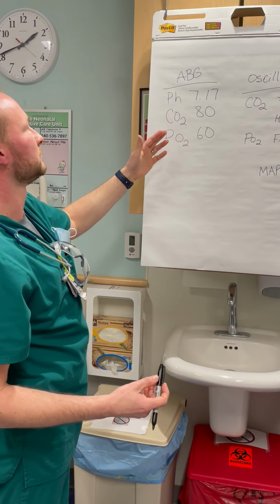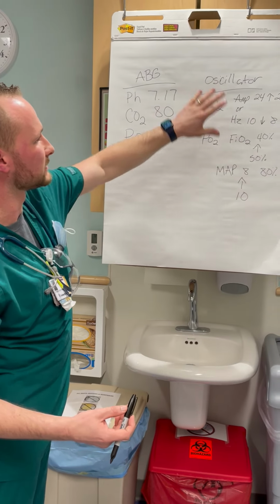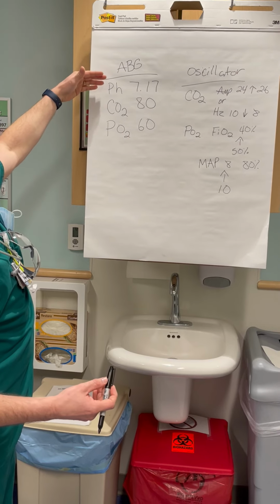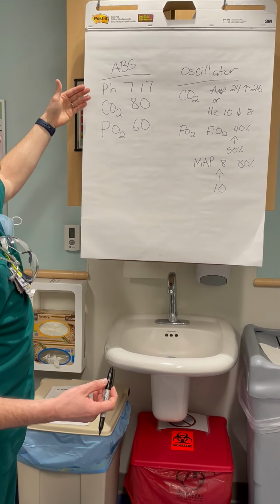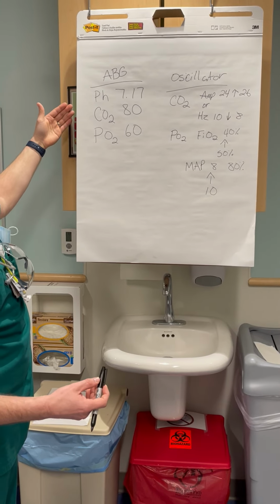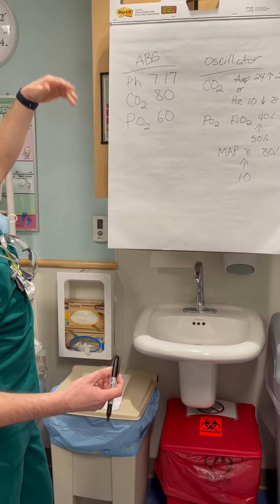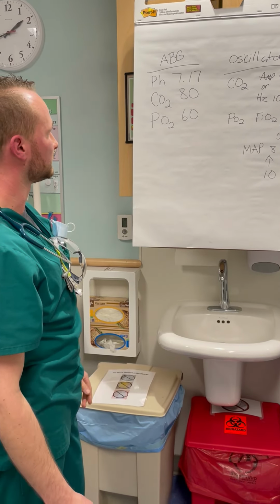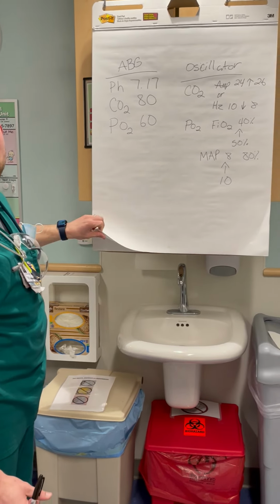And again, you may turn around and get another blood gas from these settings, and now your baby is severely alkalotic, or above 7.45, and your CO2 is in the 30s, which is not good. It is not good for a baby to have that much of a dramatic change in CO2. But if we stop there.